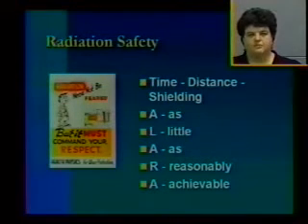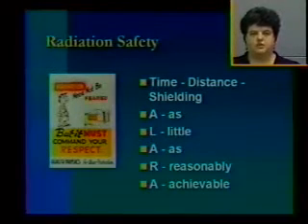The principles set forth by the U.S. government for radiation safety, there are numbers available, but what they would like everybody to remember is ALARA. And what ALARA stands for is as little as reasonably achievable. And what that means is to try and use time, distance, and shielding in order to minimize one's exposure.